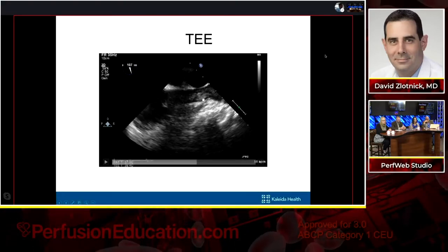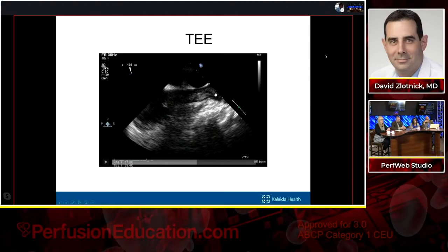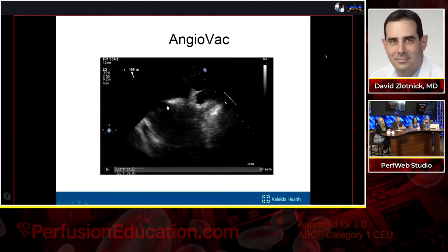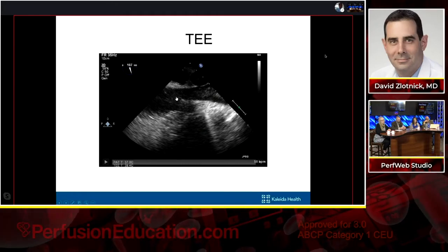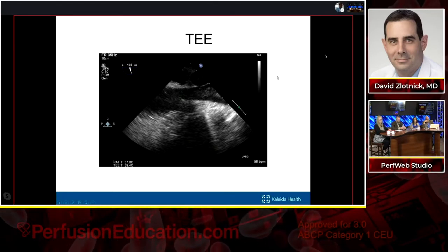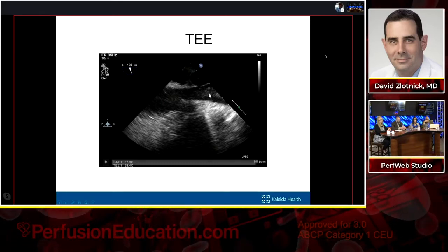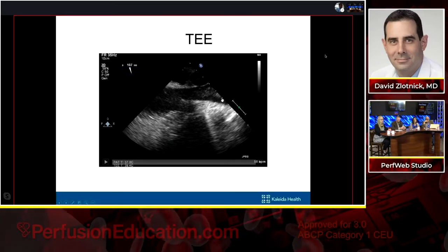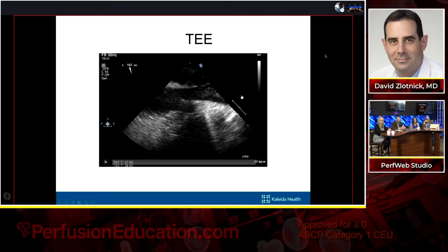So what we're seeing here, to go through it, this is the right atrium, and here's your SVC. What we can see here is basically a large clot, and you can see a mobile component right here at the SVC-RA junction. Again, this is something that we're seeing more and more of as people are leaving the hospital with different types of lines, such as PICC lines, metaports, permacaths. Even though the line was removed, the ongoing bacteremia was being caused by this persistent clot that was sitting in the SVC. So this clot is super infected with the MRSA, which was giving her persistent bacteremia.